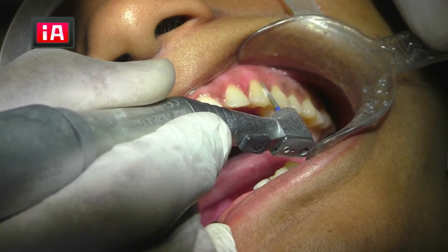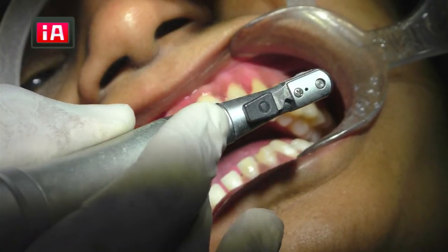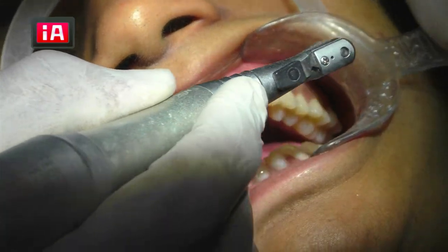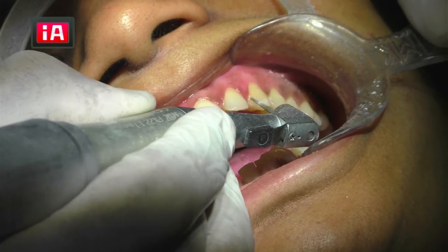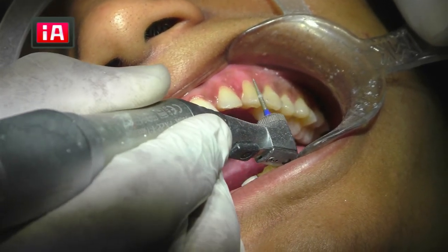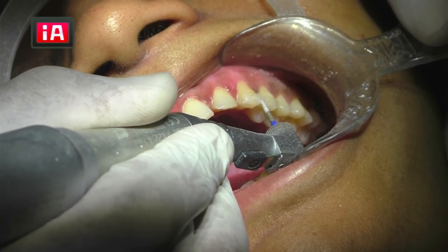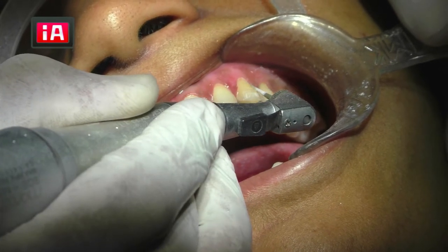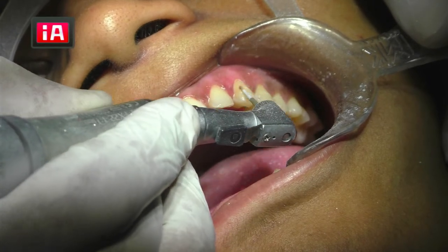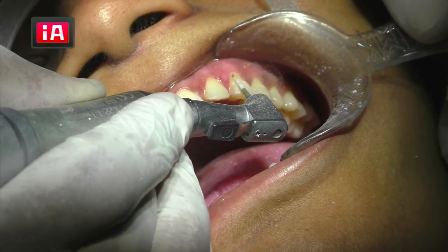One more thing you can always check is to take a putty index before the preparation, and cut the putty index and see whether your preparation is uniformly done or not. If it is possible, I'll show you my cutting with the putty index before cementation. You can understand how much is the thickness of your preparation, whether it is equal or you require more preparation.